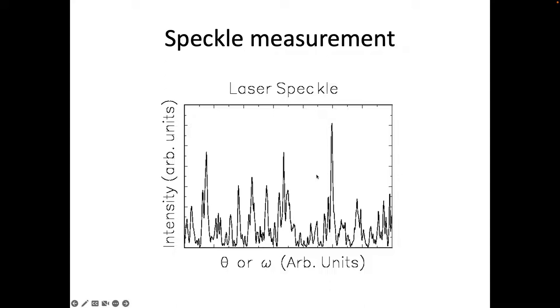How does that occur? That's basically if I can write down E is E1 plus E2 plus E3. I give you three fields that come to my detector. I can already calculate the intensity. The intensity can be E1 times E1 star, plus E1, E2 star, plus E1, E3 star, plus E2, E1 star, plus E2, E2 star, plus E2, E3 star, plus, so yeah, you get it.